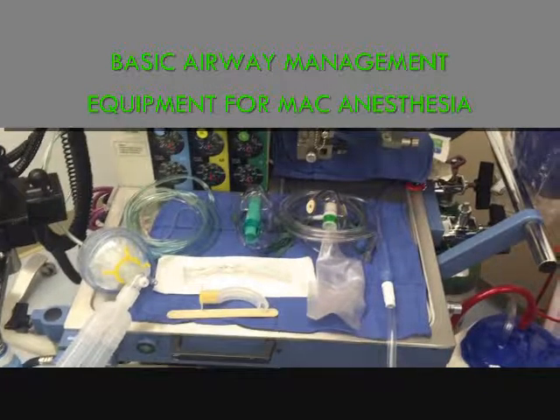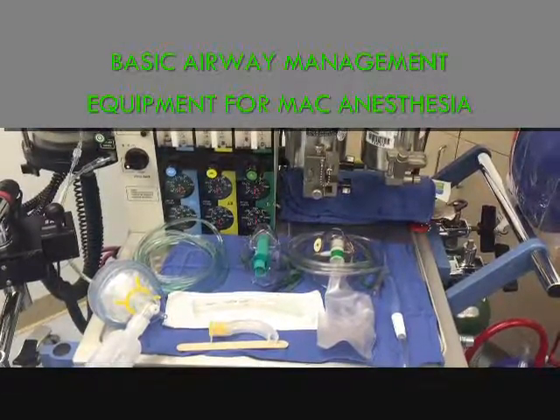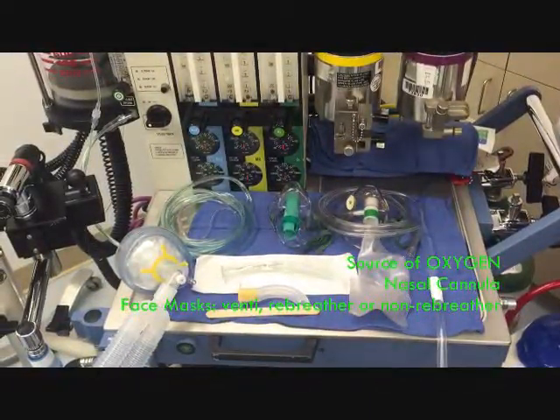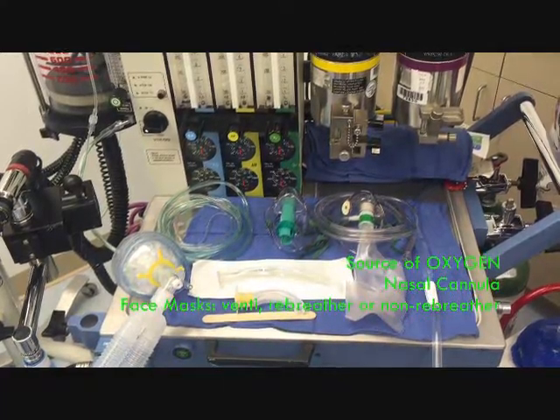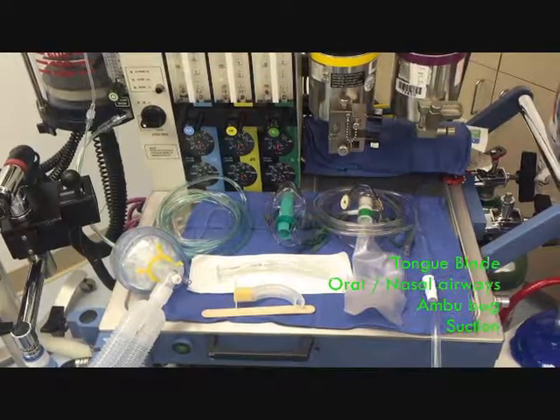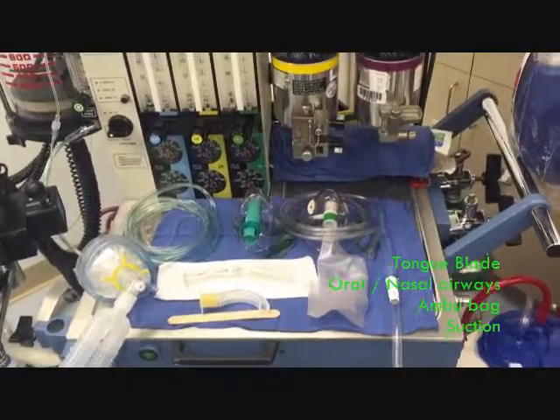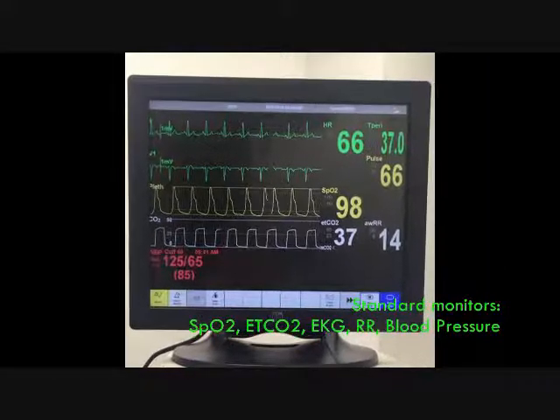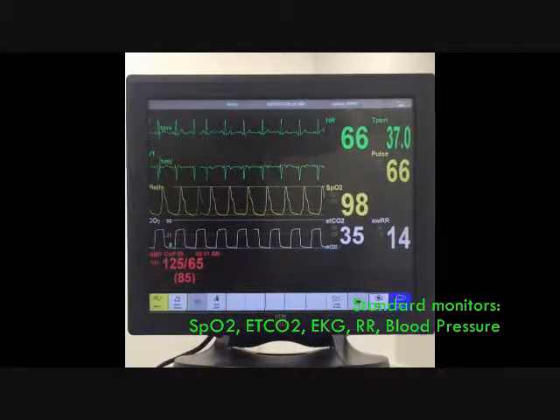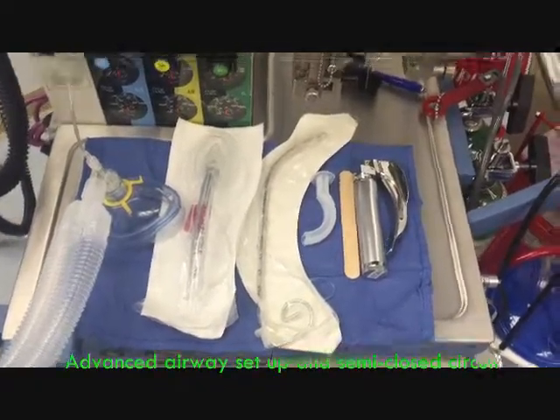In order to prepare for MAC anesthetic, gather all the essential equipment. The basic airway management equipment for MAC anesthesia are source of oxygen, nasal cannula, face masks such as venti, rebreather, or non-rebreather mask, tongue blade, oral and nasal airways, ambu bag, suction, standard monitors including oxygen saturation, end-tidal CO2, EKG, respiratory monitor, and blood pressure. Always have an advanced airway equipment and semi-closed circuit ready.